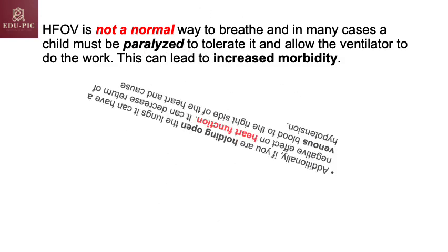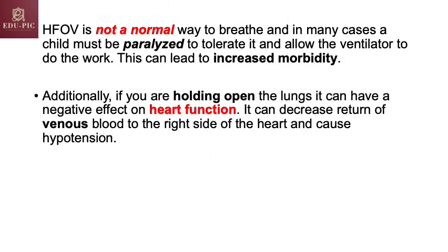Because high frequency is not a normal way to breathe, and in many cases a child must be paralyzed to tolerate it and allow the ventilator to do the work. This can lead to increased morbidity. Additionally, if you are holding open the lungs, it can have a negative effect on heart function. It can decrease the return of venous blood to the right side of the heart and cause hypotension.